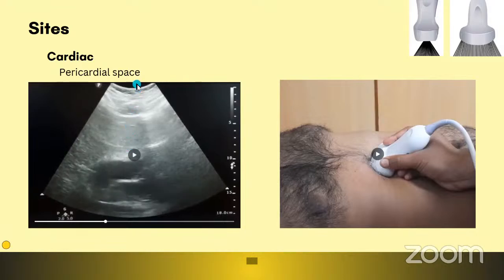So I'm using the liver substance to pass the ultrasound pulses quickly and effectively to the heart. Since the heart is filled with blood, it will eventually attenuate here. Subcutaneous tissue also has loose tissues, so it already starts to attenuate it. To preserve the energy, I'm using the liver as an acoustic window.